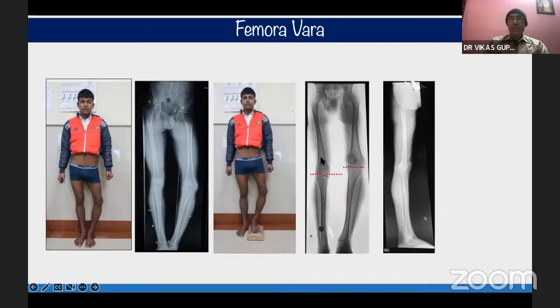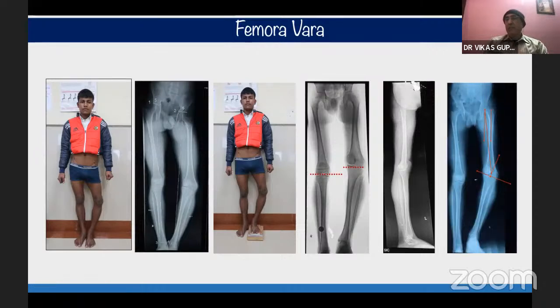So this was redone. You could see that this is the way the patient should be examined and the X-ray obtained. So you could get the proper scanogram, both in the AP and the sagittal view. And one could see that once we have done the planning, there is not only a 5 centimeter shortening, but the CORA point was just juxta-articular.